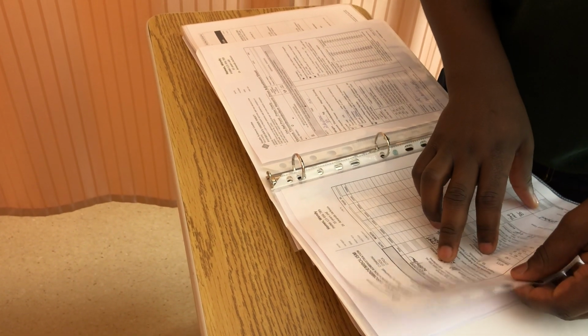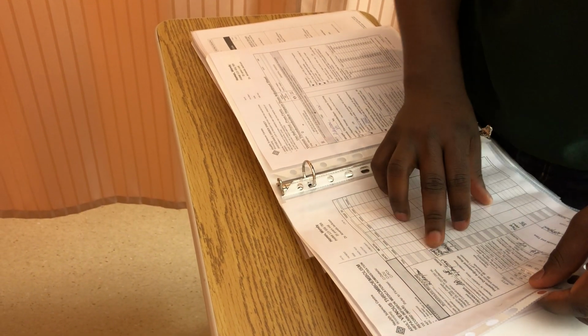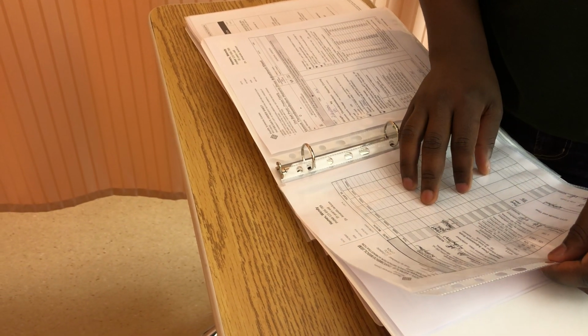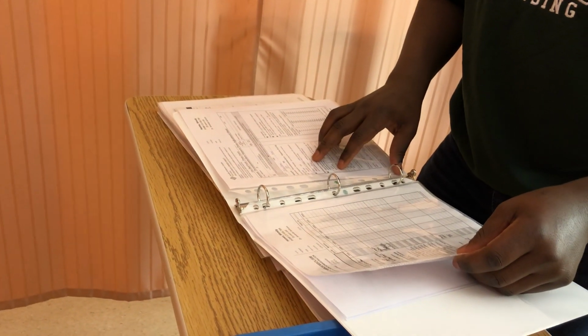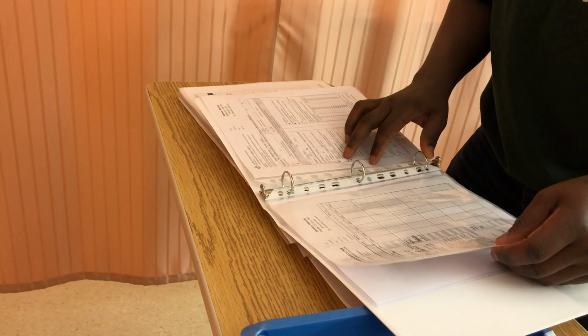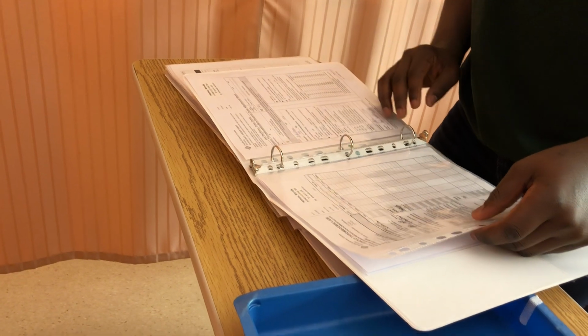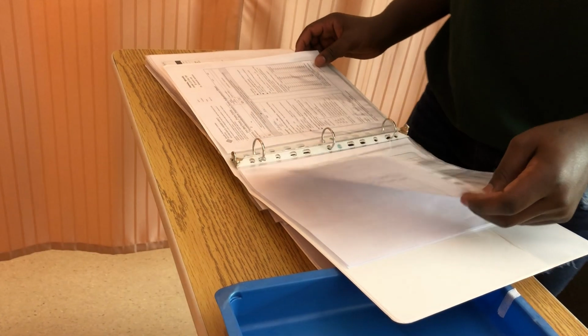Final concentration for this is 100 units per ml, and it says to start at a rate of 1350 units per hour. So I've checked that, and it says it's an initial infusion here, 1350 units per hour. So that's the rate at which I will be administering this, and there's no loading dose, and adjustment will be done later as the patient goes through this.